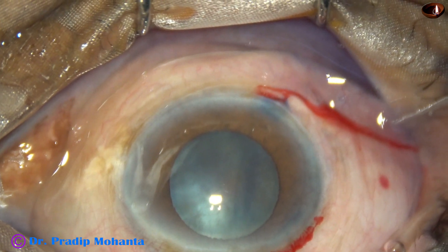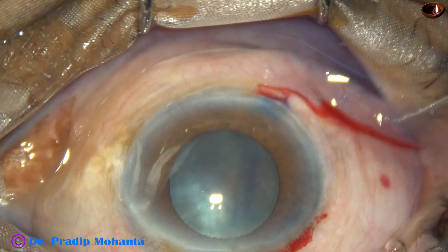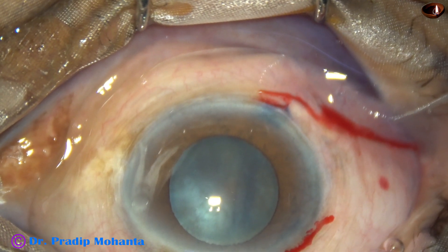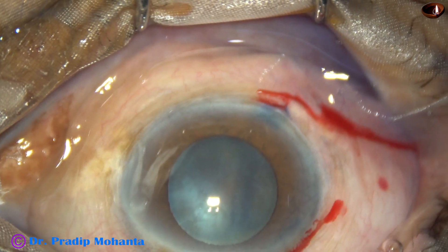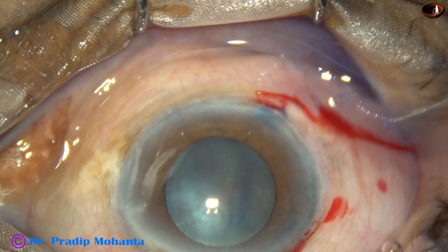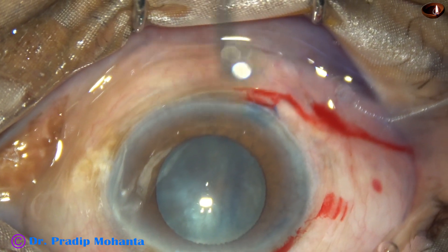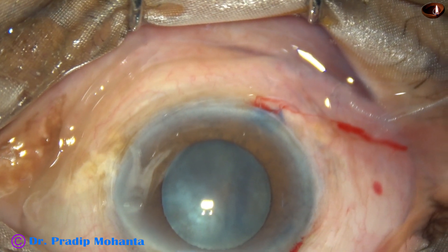So we will get a capsulorhexis of about 5 mm, and once we get a rhexis of that size, even if the pupil becomes small during surgery, sometimes we can manage. However, if necessity arises, we must use a pupil expansion device. In this case, I could easily manage without using any pupil expansion device.